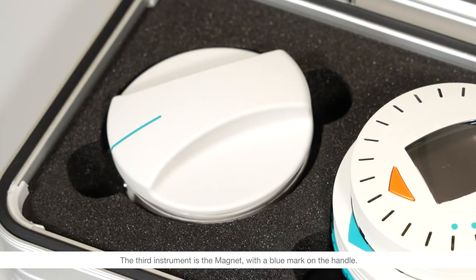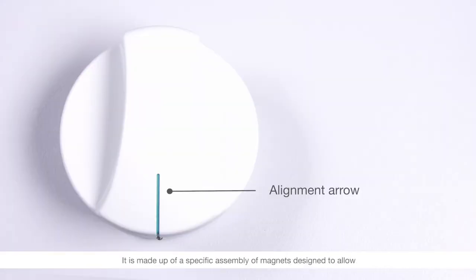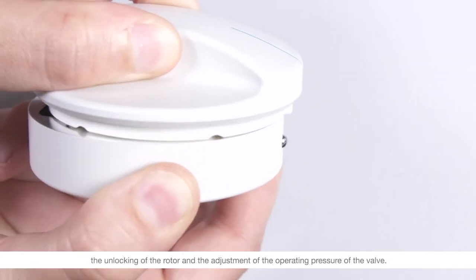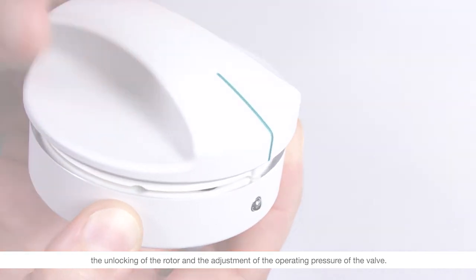The third instrument is the magnet with a blue mark on the handle. It is made up of a specific assembly of magnets designed to allow the unlocking of the rotor and the adjustment of the operating pressure of the valve.